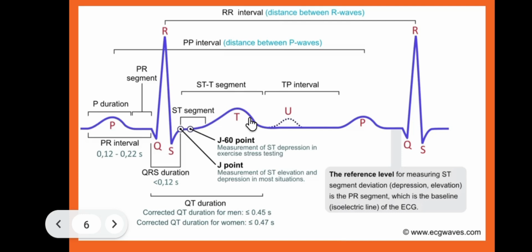The normal duration for this one is 0.36 to 0.44 seconds. Well, that's the standard, that's the ideal, but it could vary with heart rate.